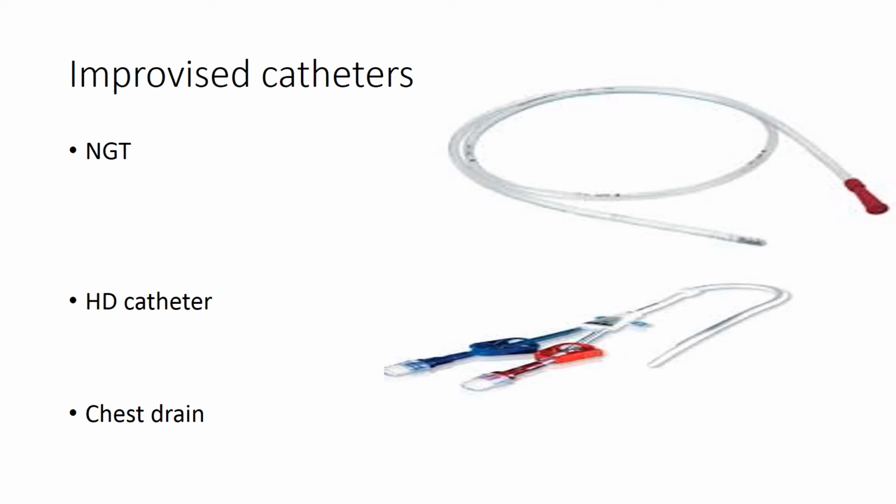I have had colleagues that have used adult hemodialysis catheters placed into the abdomens of infants, particularly neonates, and then use one hub for inflow and the other hub as drainage. And if you are lucky enough to have a burette, you can attach your fluids and give through a burette so that you can more accurately measure the amount of fill volume, and also be able to accurately measure the outflow and therefore calculate the ultrafiltrate.